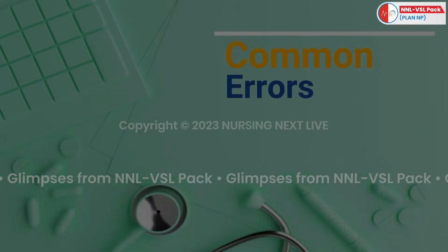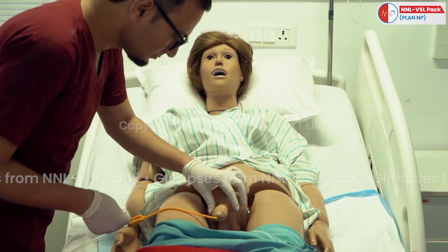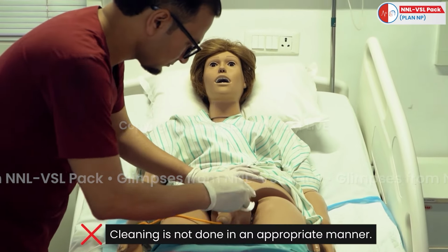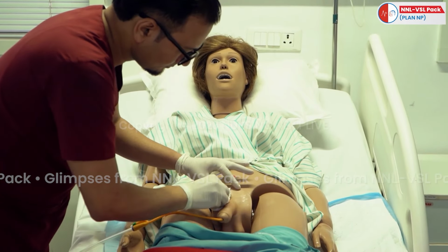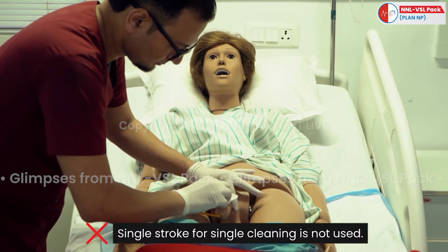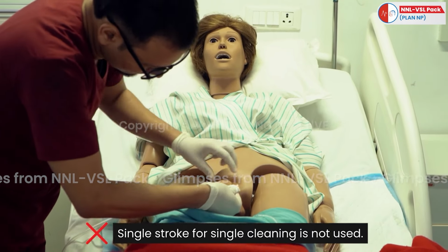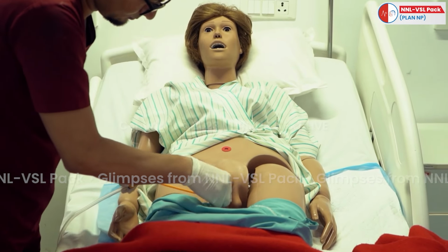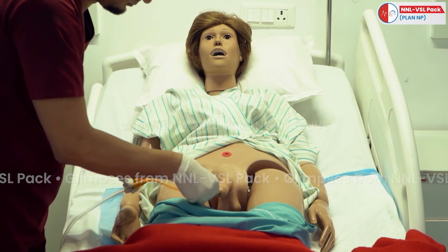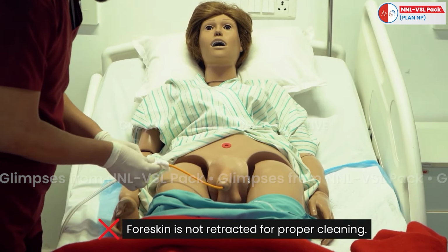Common errors. Position is not given. Cleaning is not done in an appropriate manner. Single stroke for single cleaning is not used. Foreskin is not retracted for proper cleaning.